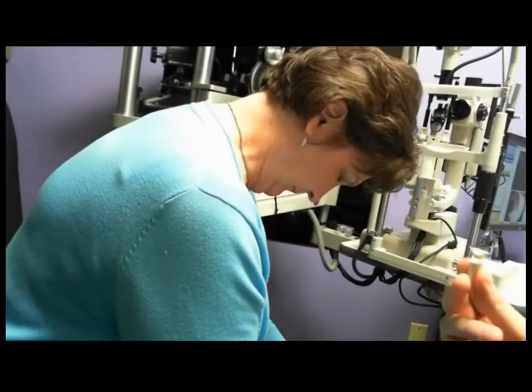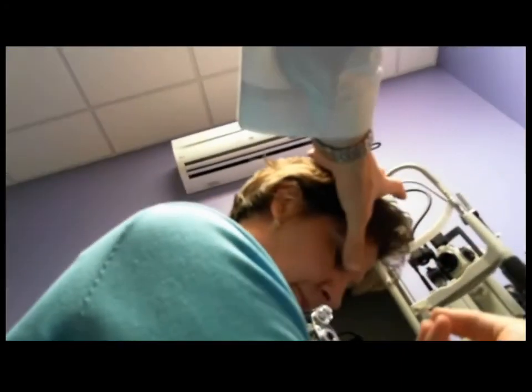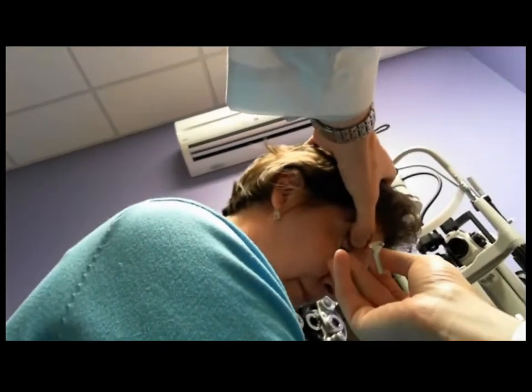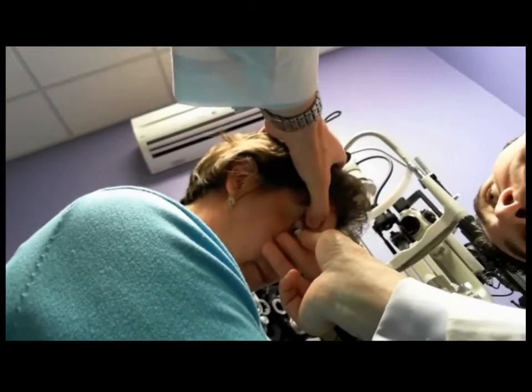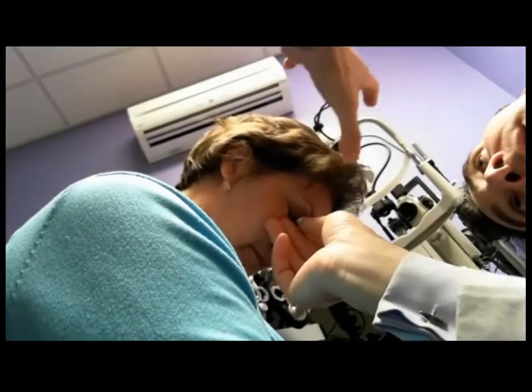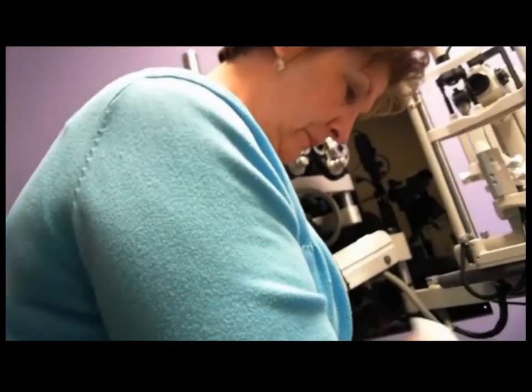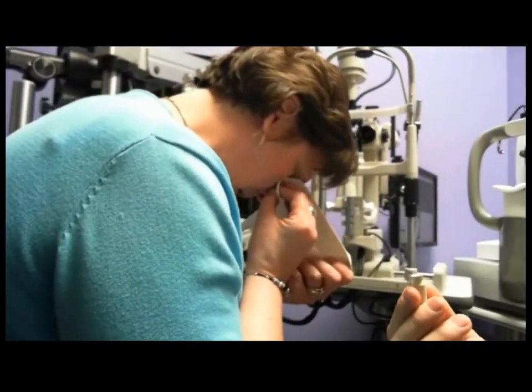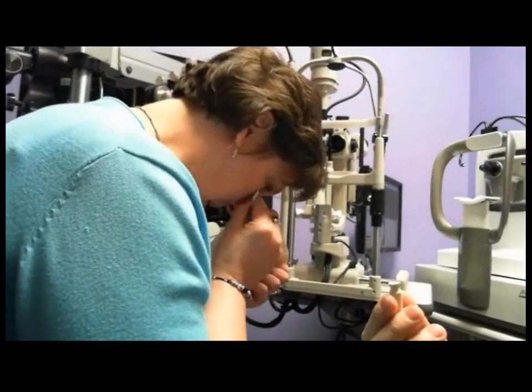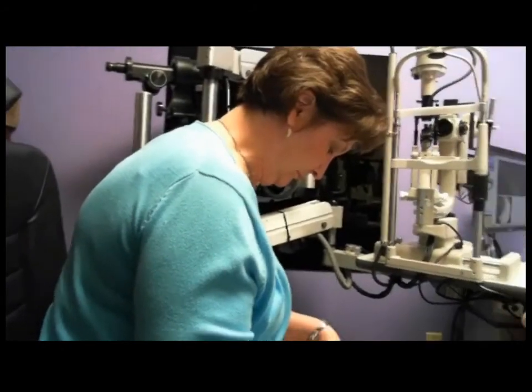Okay, so let's give this a shot. So Darlene, you're going to look straight down. I'm going to immobilize the upper lid, move the lower lid out of the way, and close. And you can see that one of the keys was that I didn't move the plunger away until I had her eyelids closed. And the eyelids will grab the lens onto the eye.